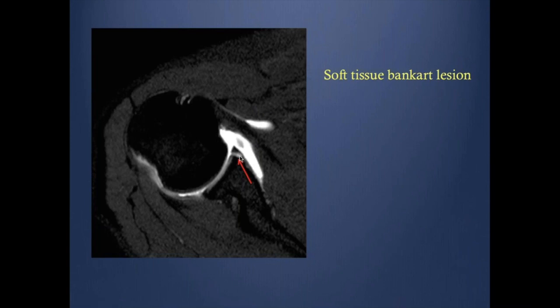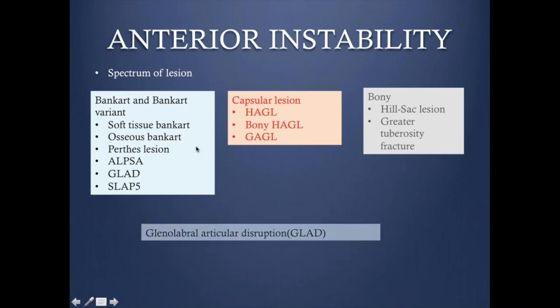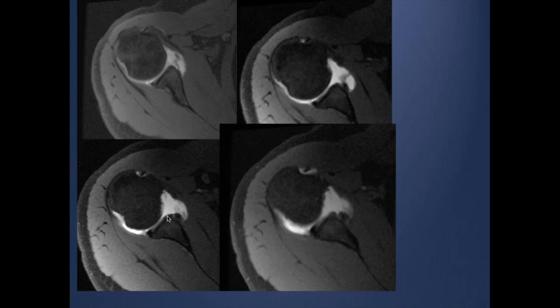We describe glenoid labral abnormalities using a clock position, with the bicipital tendon origin at the superior labrum at 12 o'clock, inferior labrum at 6, anteriorly at 3, and posteriorly at 9. The typical area for a Bankart lesion is the anterior inferior region. In another example showing complete tear of the anterior labrum with medial retraction, loss of the triangular appearance, and anterior cartilage involvement, this would represent ALPSA combined with GLAD. Rather than forcing a single name, it is better to describe the full abnormality.